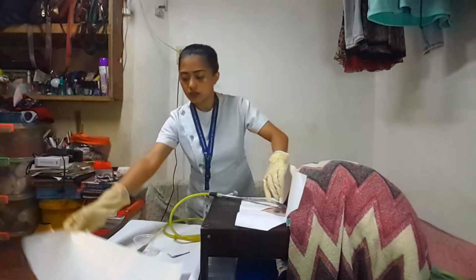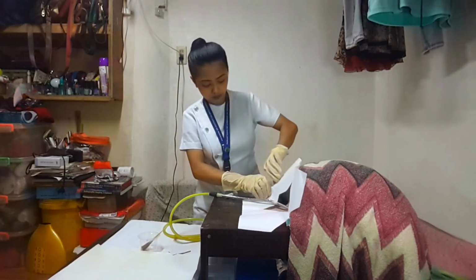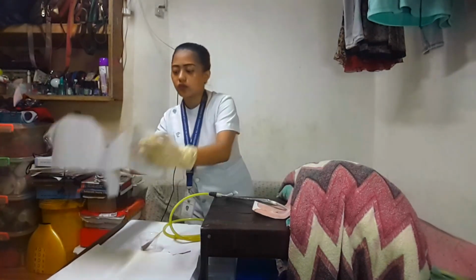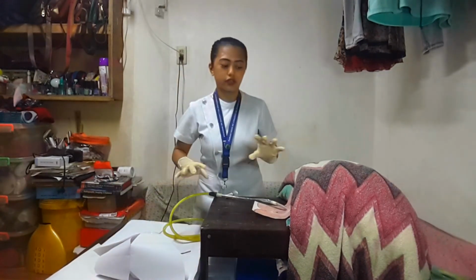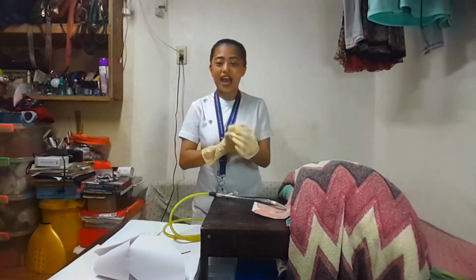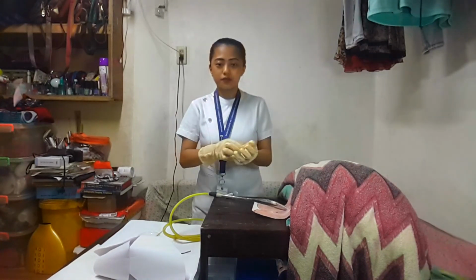Okay, so remove all of the drape. Alright, so now we've already removed the drapes, and position the client where she is comfortable. And after that, we need to remove our gloves.